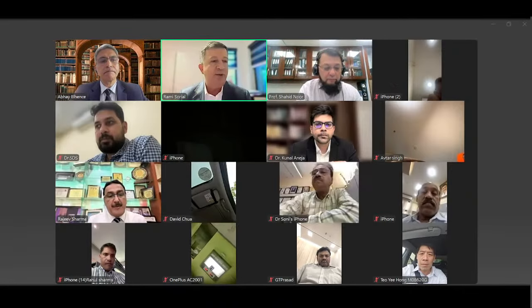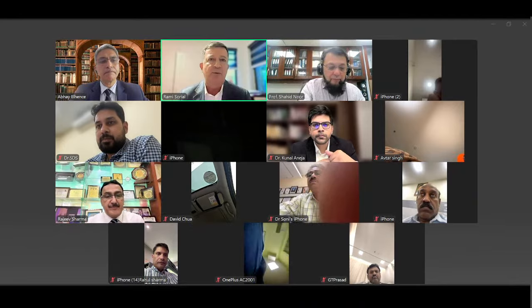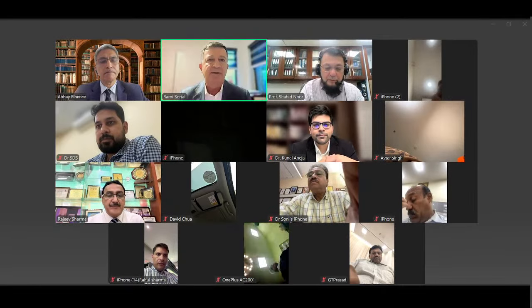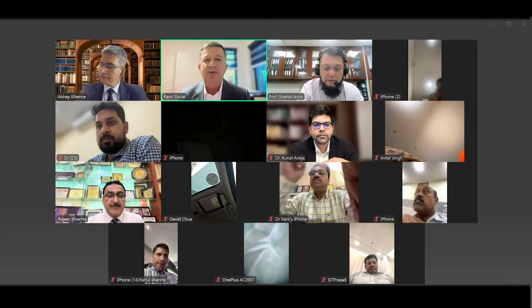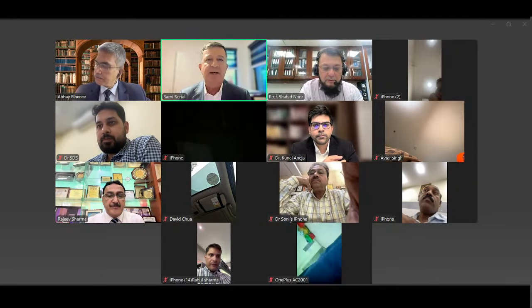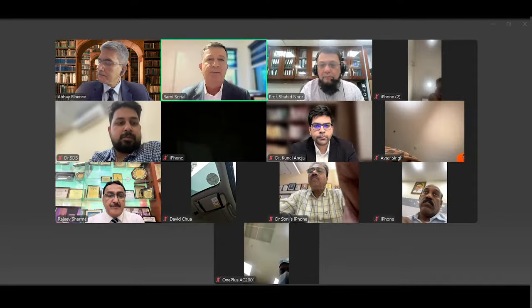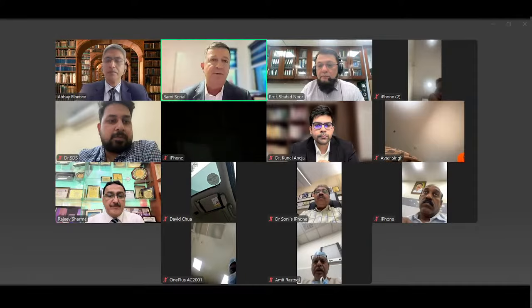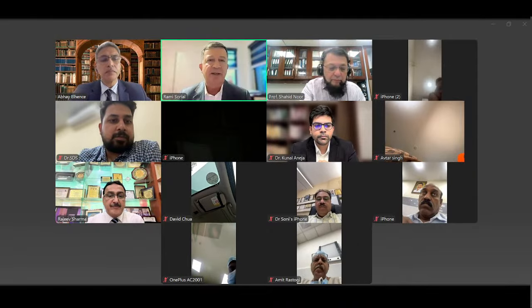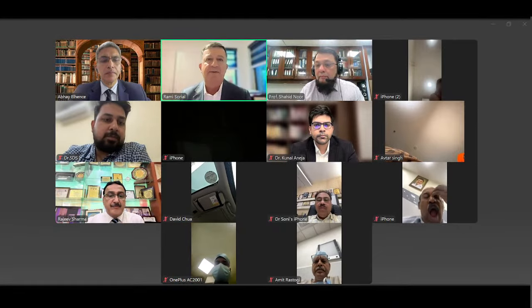In terms of protrusio, you saw that case I shared with you. That's not a straightforward hip replacement. And the question here is, do we use primary implants or do I have revision gear? By using this a week ahead, I made the decision I don't need revision gear there. I can actually do a primary here because I can see the fit, and it's a three-dimensional way of optimizing the position and the fit of that acetabular component, giving you confidence to proceed. Now, in our country, we can have every implant on the shelf, but in countries that can't do that, I can see that as a definite benefit.